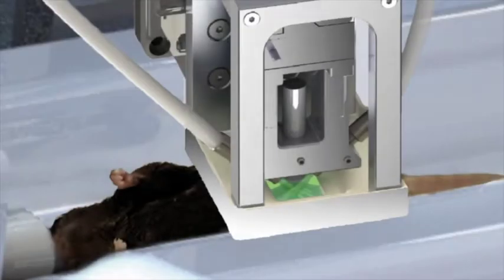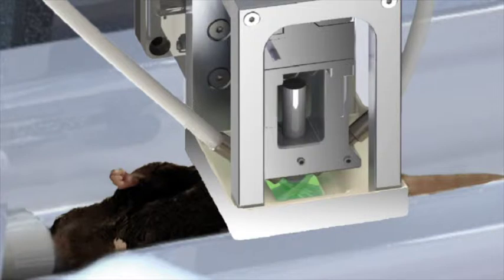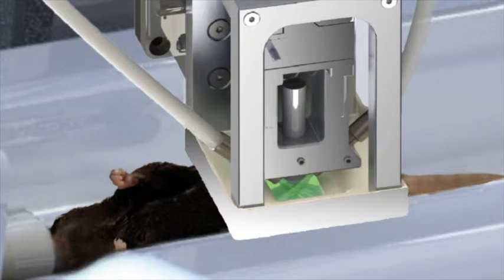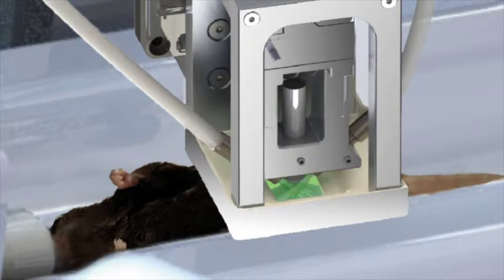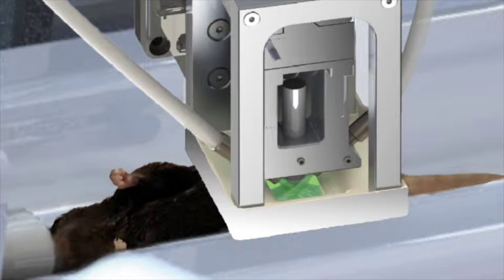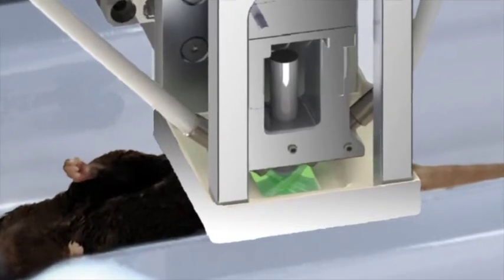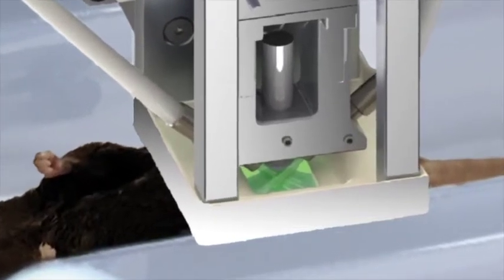Raster scanning optoacoustic mesoscopy can be performed on a preclinical system equipped with a small animal bed. The scan head, equipped with two light sources and an ultrasound detector, is directly placed over the shaved skin of the animal.